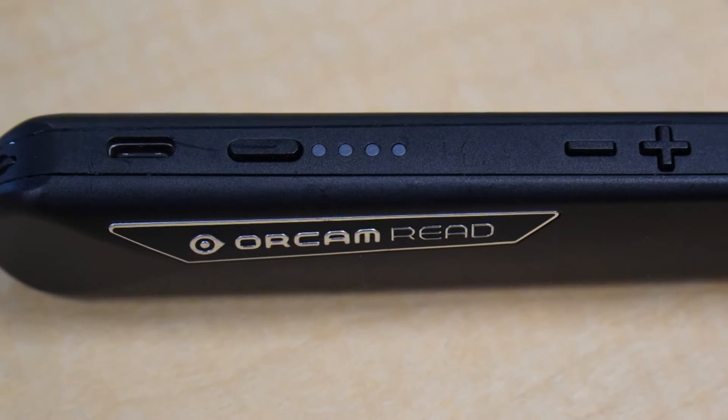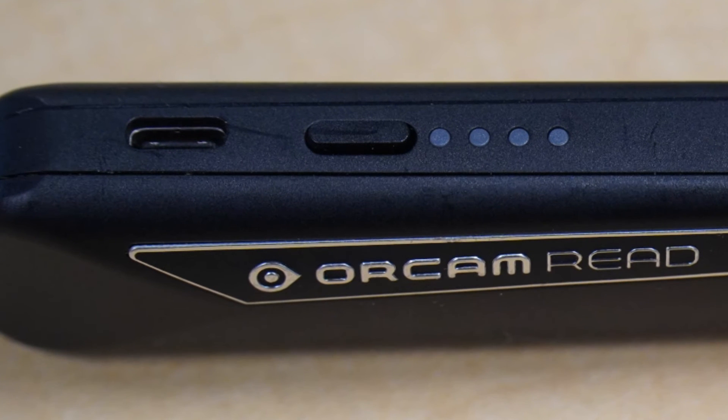The final button on the device is the power button, located toward the top of the device. That one will allow us to put the device to sleep, and also turn it off and turn it on. So there's not too many buttons, and the ones that are there are very tactile, which makes it very easy to use.